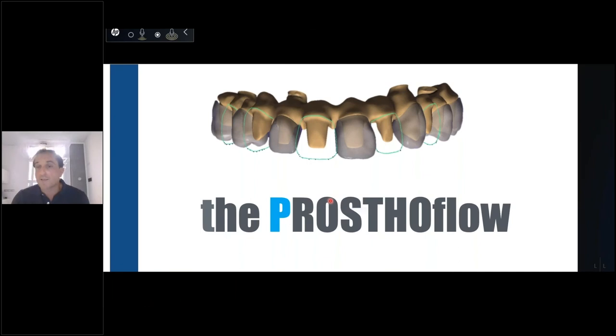And now I can finish my therapy. And now I don't want to change the position of my mandible. This is the final position. Is it the central relation? Okay. You want to call this position biological position? Okay. But I have a device, Teethan, that helps me to know if this position is good for my patient.